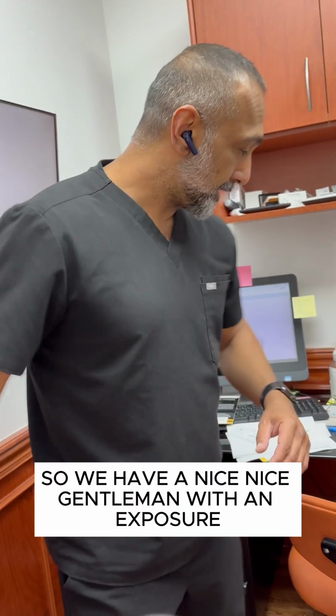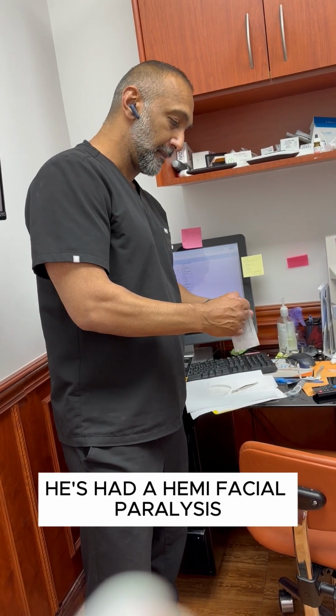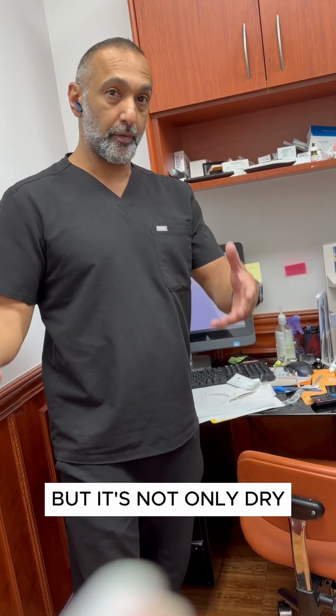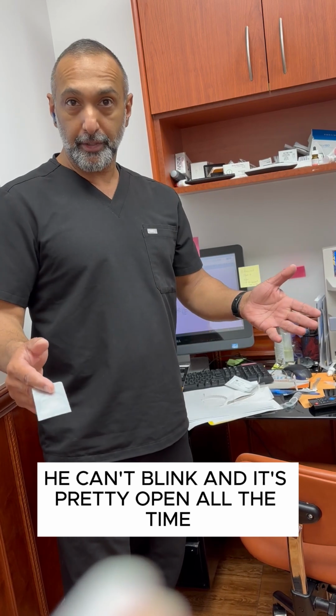Hi, okay, so we have a nice gentleman with an exposure keratoconjunctivitis of the left eye. He's had a hemifacial paralysis. He's been told by other providers that his eye is dry, which loosely is true. His eye is dry, but it's not only dry. It's dry because it can't close. It can't close, he can't blink, and it's pretty open all the time.